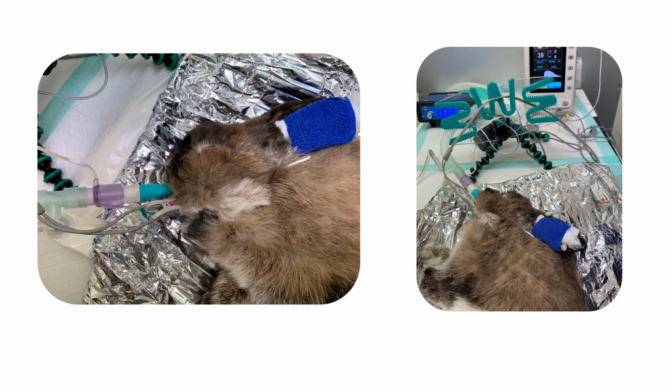And here we can see a rabbit under anaesthesia. You can see on both pictures that little blue bandage that's covering an intravenous ear cannula. You can see the v-gel and advanced in place, pulse oximetry probe in there. That's a pediatric CO2 capnograph connector. Pediatric connector has a reduced dead space going through the middle, so we're not making it harder for a patient to breathe. And then you can just see behind the ears a little bit of our tie that's securing and holding that v-gel in place.